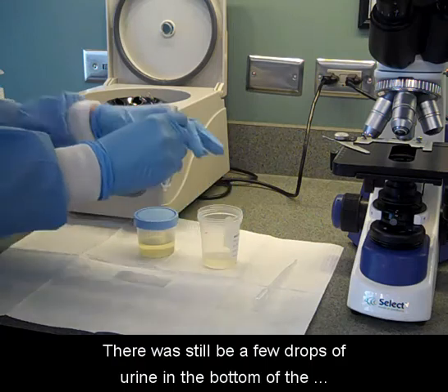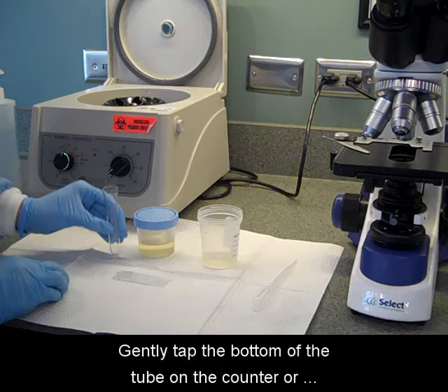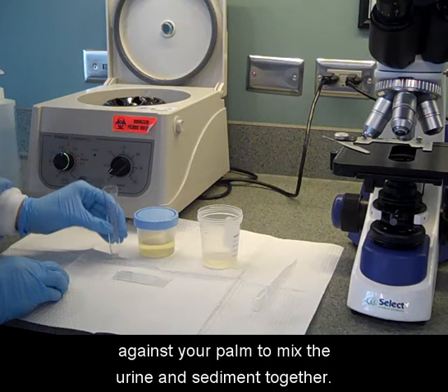There will still be a few drops of urine in the bottom of the test tube with the sediment. Gently tap the bottom of the tube on the counter or against your palm to mix the urine and sediment together.